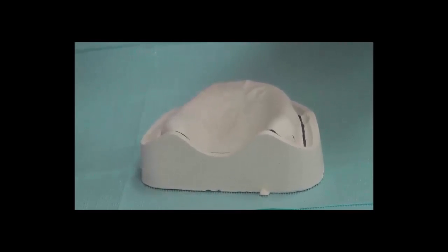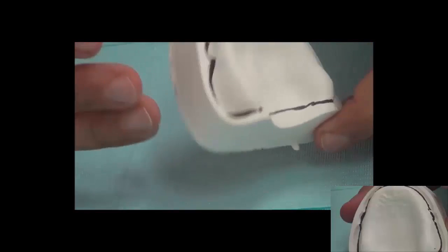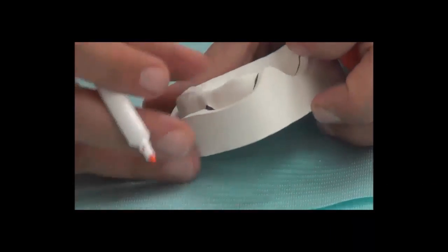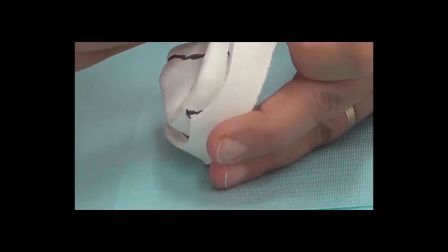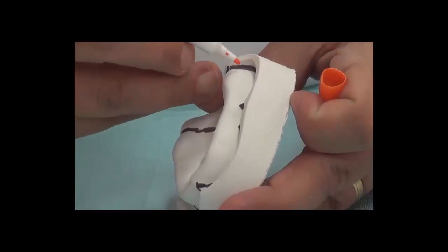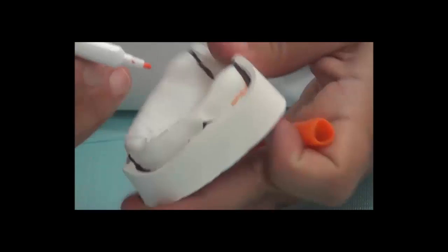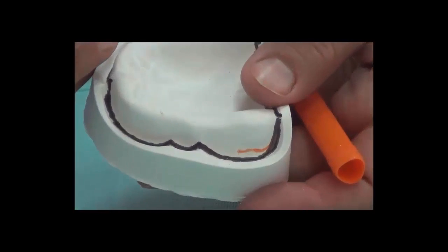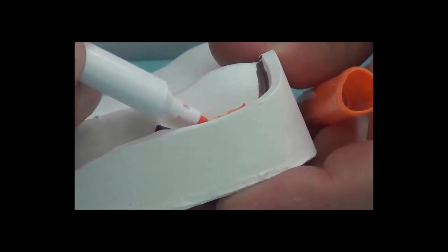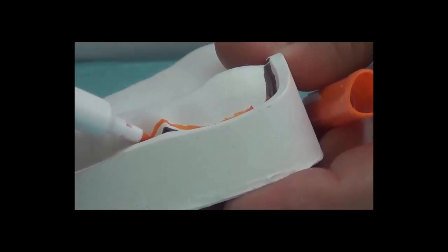The outline of the tray is far away from this by 2 millimeters. So when I'm going to draw the outline for my tray, I should draw the same line, the same morphology of the line, but 2 millimeters away from the depth of the sulcus. That's why we drew the first line, to make sure that we're drawing 2 to 3 millimeters away from the sulcus. And once more we follow the same morphology.